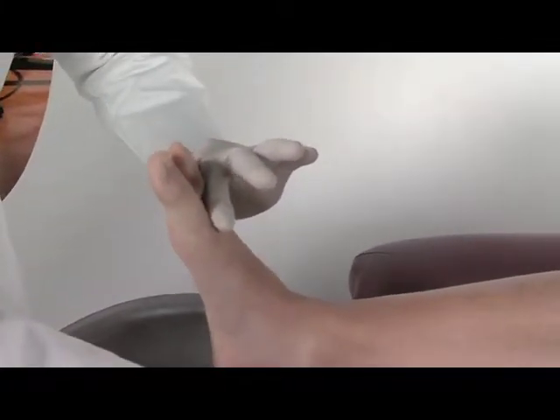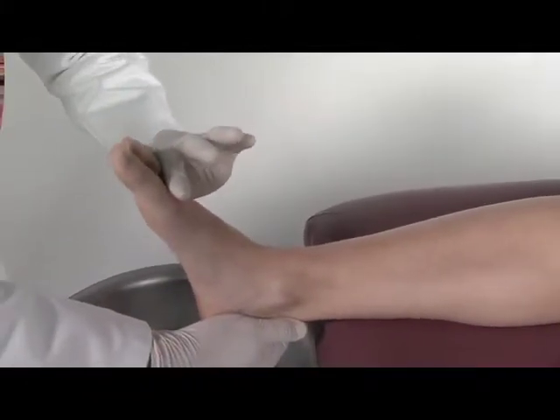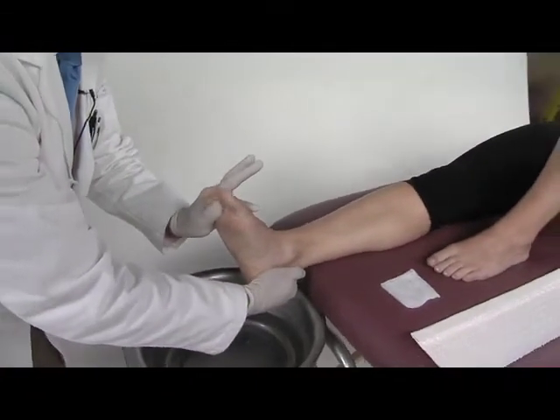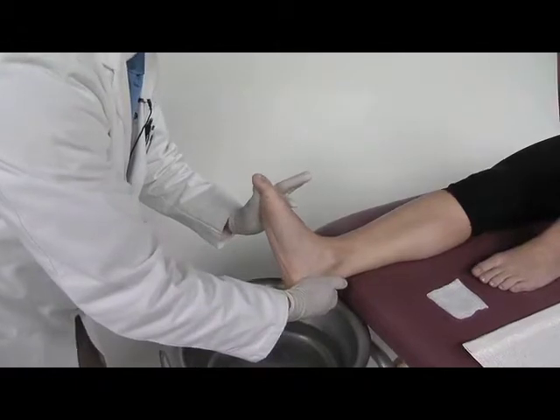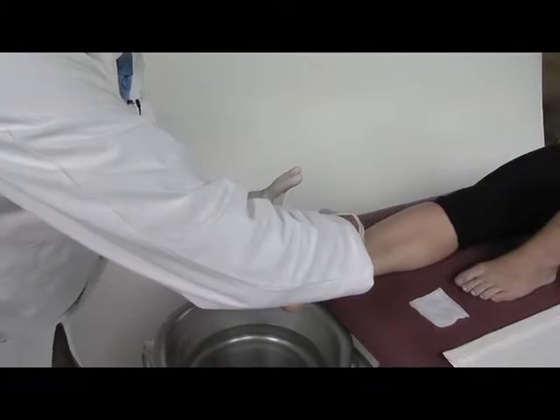So Lisa, go ahead and relax your butt, relax your calf, your quad, relax everything. Great — that'll make it a lot easier for me to hold you in position. We don't want the foot to be supinated nor pronated; we want the subtalar joint in a neutral position.